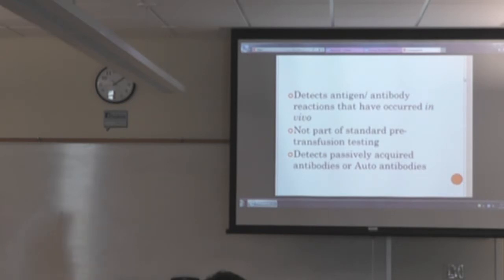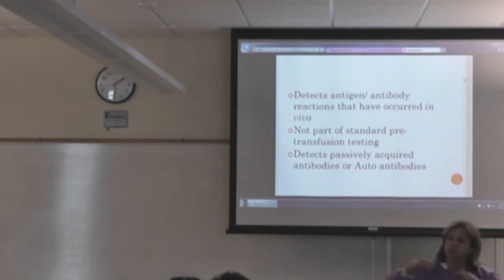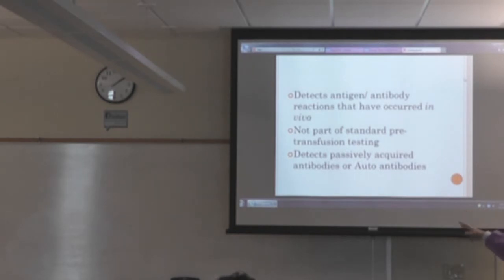So it was very interesting because I thought, okay, did they misdraw this baby? Do I have the wrong specimen? He's positive, the mother has anti-big E. Why are his cells not affected? Or are they so affected that it's looking negative because it's so positive? So then you look for icterus. How much icterus, how much cell destruction do you think is going on in that baby? So we look at the icterus, and his plasma was really clean, and it was really clear, and it was really pretty. So then I go back to my original hypothesis, that they misdrew the specimen. But we determined it was an IgM, so the baby was somehow stimulating the mother's production of anti-E, but had not gotten beyond the IgM into the IgG phase yet. So it hadn't crossed the placenta, it hadn't affected him yet. So he was perfectly fine, but she now has the antibody.